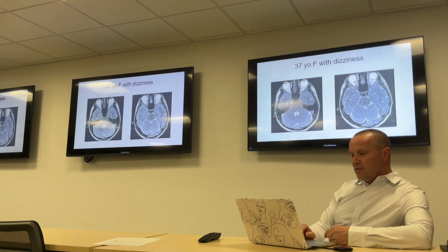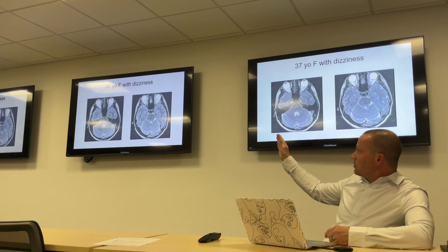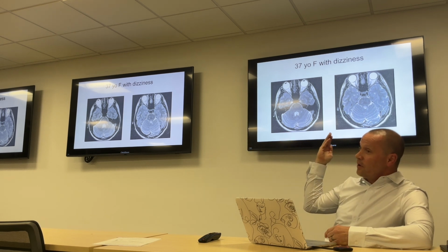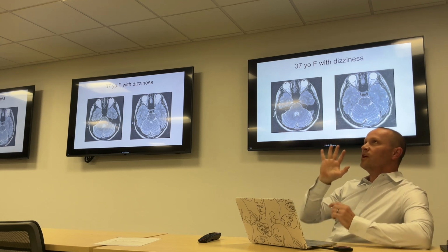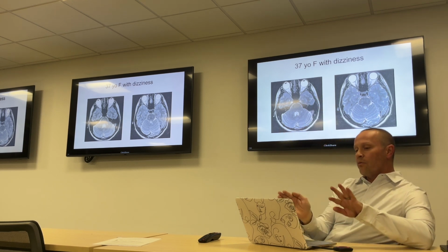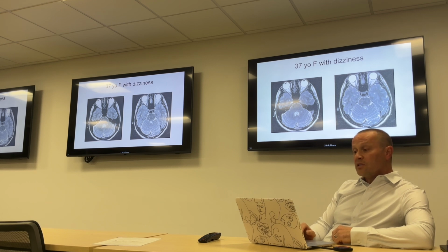And you can see right here in the right side of the pons, this little white spot. Similar little white spot over here. By the way, to orient again, when a radiologist looks at a picture, the right is the left is the right, so I'm not that confused. We're actually imagining the slices going through the patient and we're looking up towards their head. So the right eyeball is the one on the left side of the image. So when I say this is in the left middle cerebellar peduncle, this is in the right side of the pons. Those little spots, I should have seen those initially.